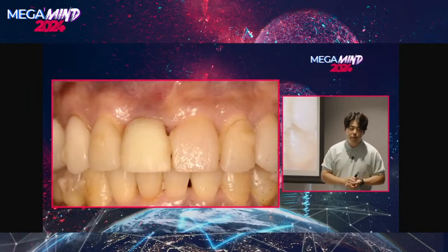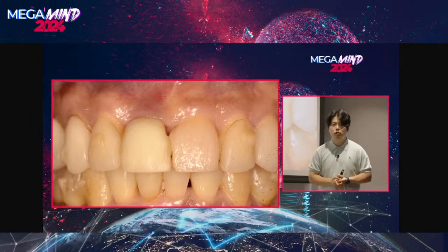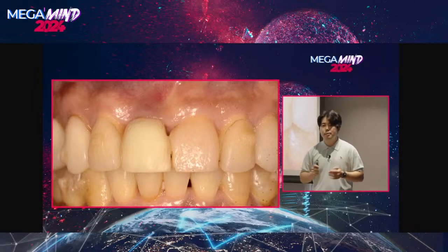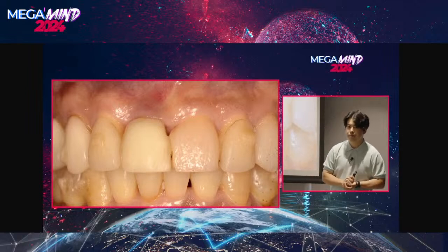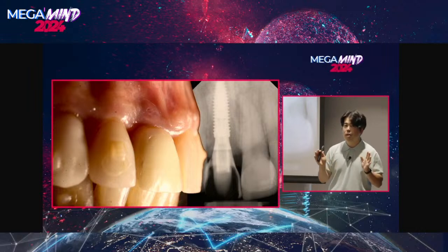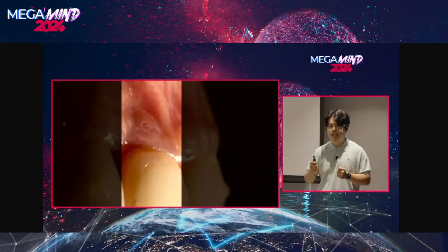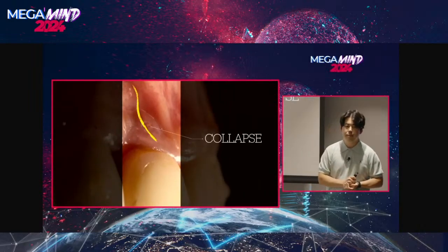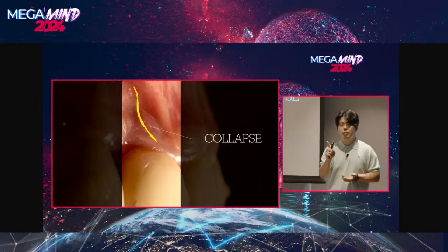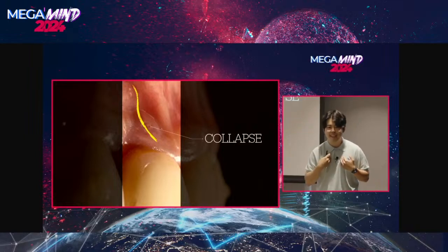So today, I'd like to start off my presentation with this particular picture. And this is a case that I did about 2 years ago. It's an immediate implant with immediate loading. And if you look carefully, you may notice something is a little bit off. Maybe you can see better in this view. Let me tell you this, immediate post-op, 3 months post-op looked wonderful in my eyes. But after a year, after 2 years, this is what I see. The buccal contour has collapsed into a concavity. Now, how many of you have observed the same situation in your own cases? Or is it just me?